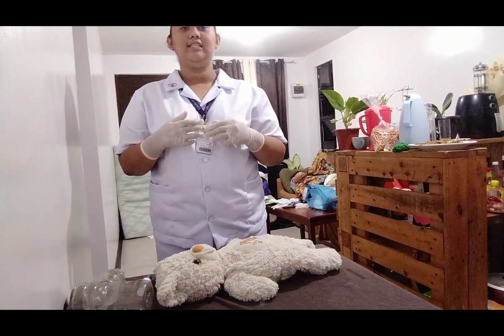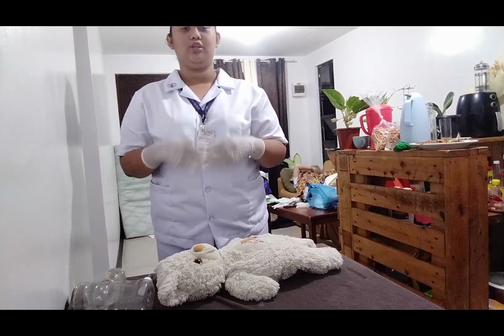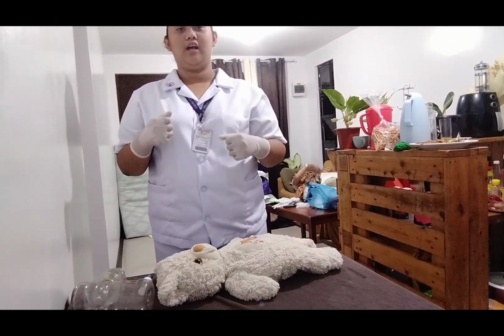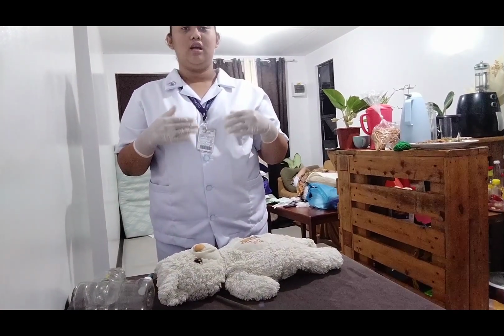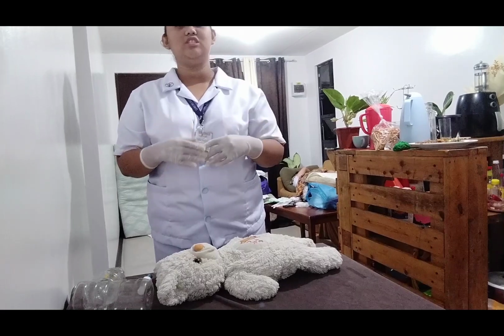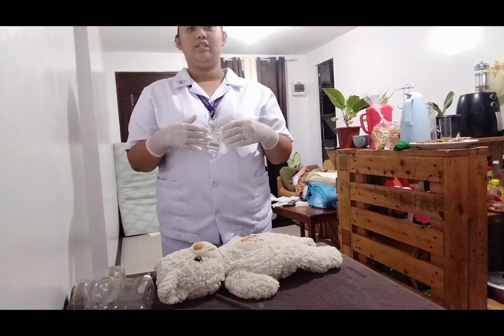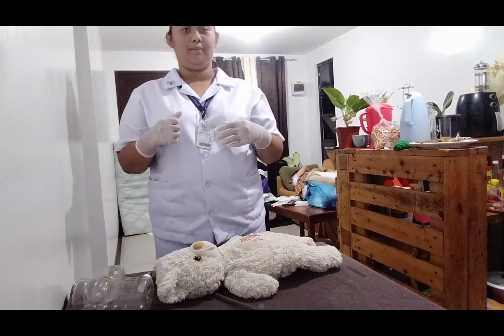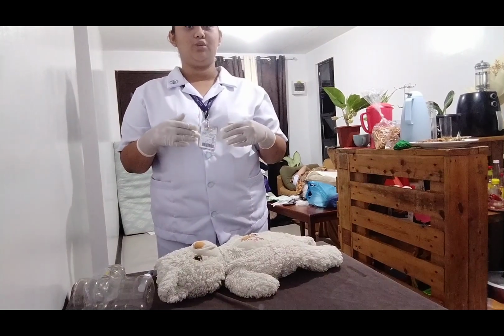Now, after doing that, someone will be attaching a cardiac monitor and pulse oximeter to keep track of the baby's heart rhythm. The pulse oximeter measures the hemoglobin oxygen saturation, and this will help us to monitor the efficiency of the CPR. If there is no increase of the heart rate after performing the PPV, we'll have to proceed to perform chest compressions and rescue breaths.